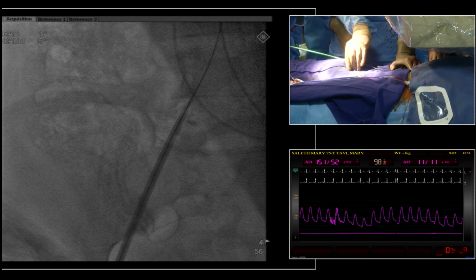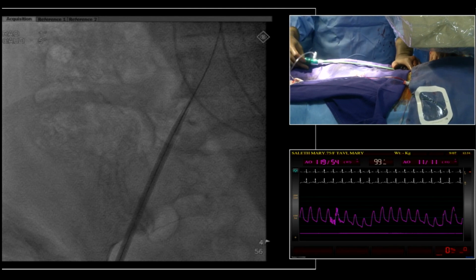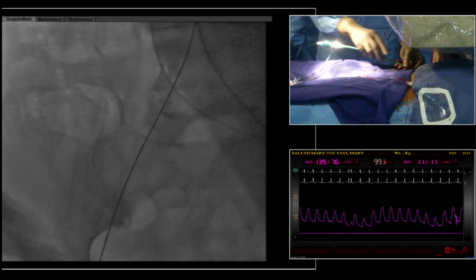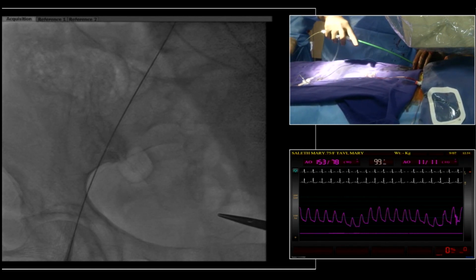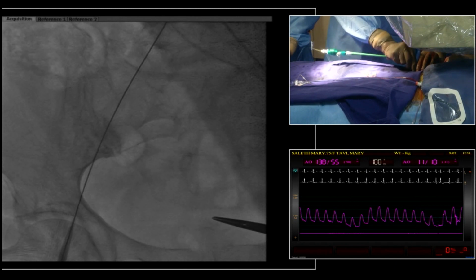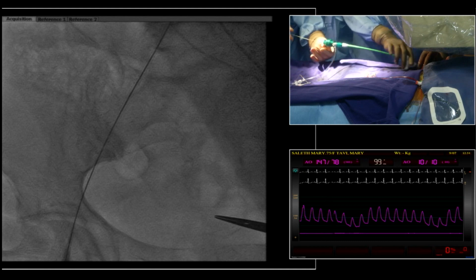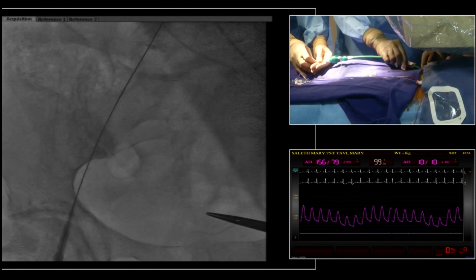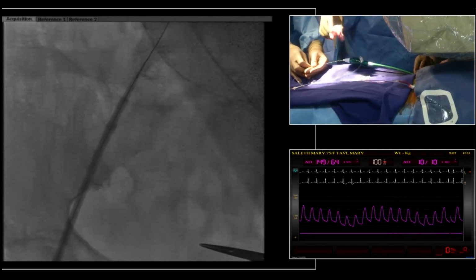So there are inherent advantages, and follow that protocol. Don't think that on one patient you won't do it, and on another patient that's better, perhaps you'd use 2 dilators. I think it's a system, everybody follows it. In fact, either one has serial dilators, or now we have a universal dilator, where you can use one dilator to do the entire dilatation and then put the sheath inside.